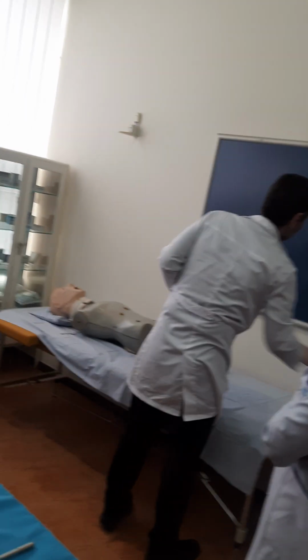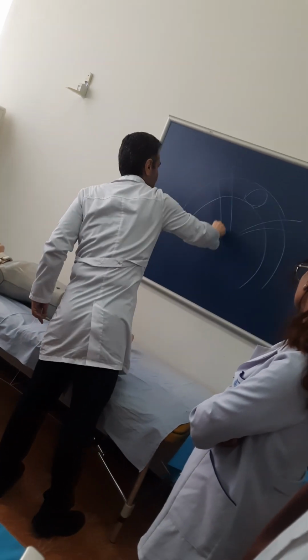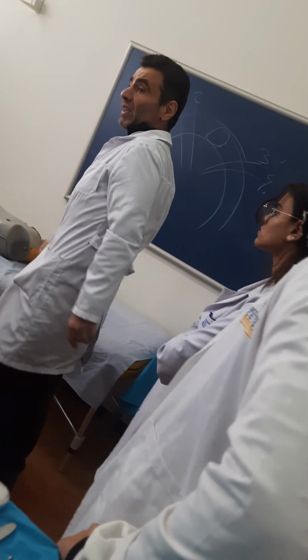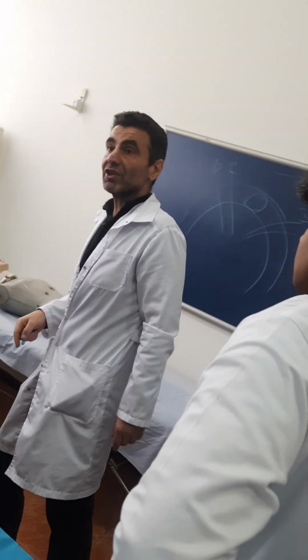What kind of intestinal clamps can I use? Primarily, I will apply here 4 intestinal clamps: 1, 2, 3, 4. And of these 4 clamps, the first and fourth will be occlusional. The second and third will be crushing.